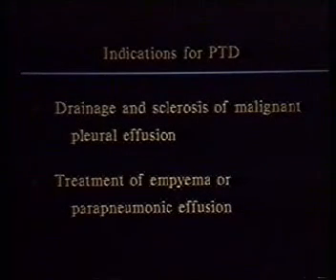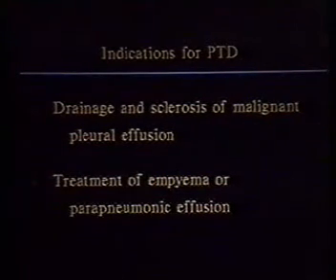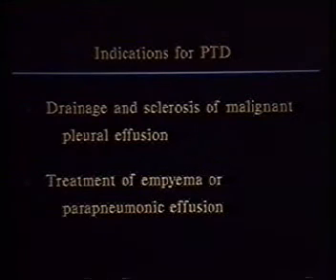Our indications for percutaneous drainage of fluid collections include the following list. At the University Hospital, the predominant indication for this procedure is for the treatment and symptomatic improvement of patients who are found to have malignant pleural effusions, usually secondary to either breast or lung carcinoma.